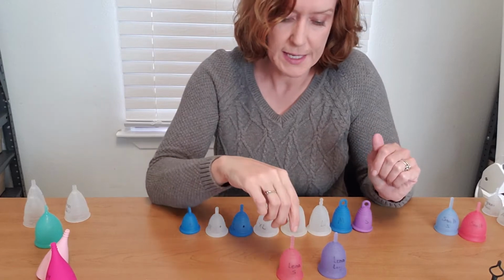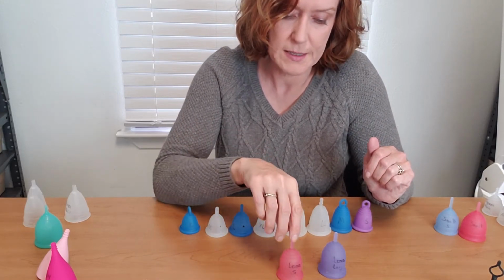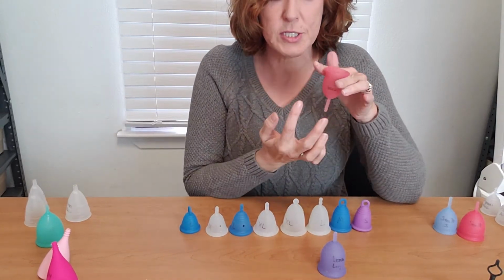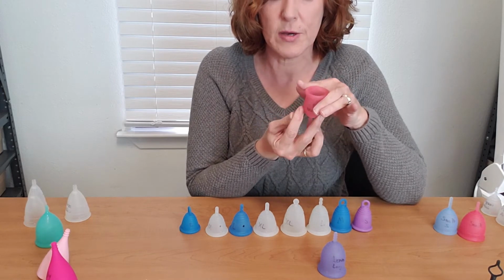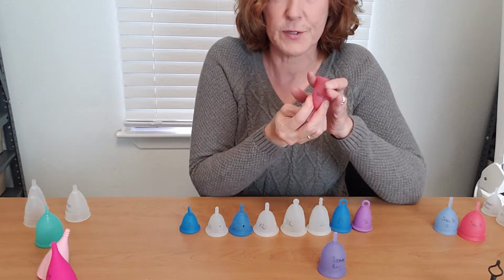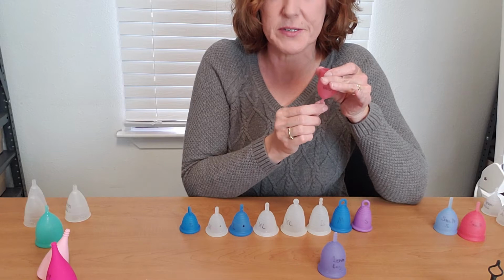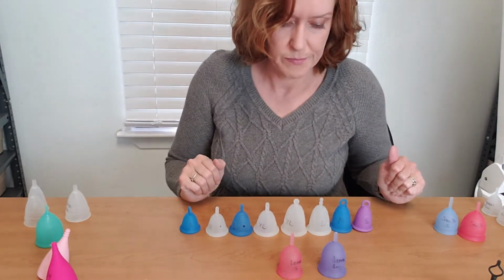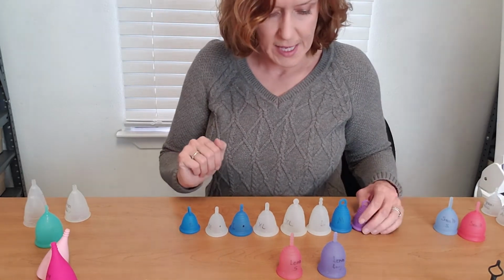Again, keep in mind, just because you have a long handle doesn't mean you can reach this cup, because as always, of course, you have to reach the cup to break the seal. So you want it long enough to break the seal with your fingers first and not just pull it out while it's still stuck. So a really long handle doesn't always help you in the way that you think it will help you.